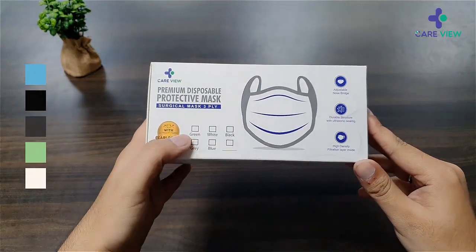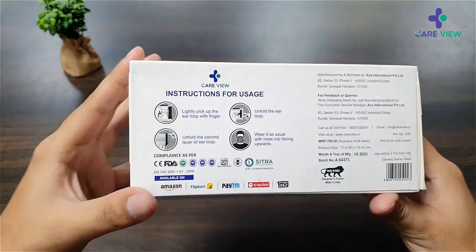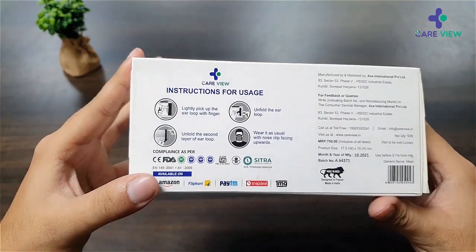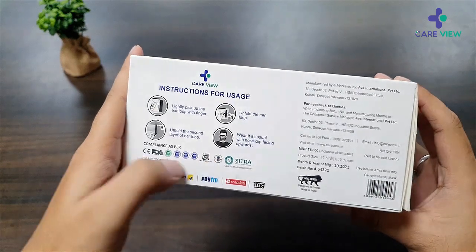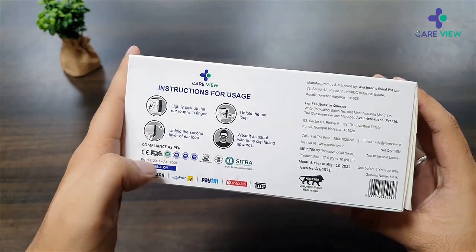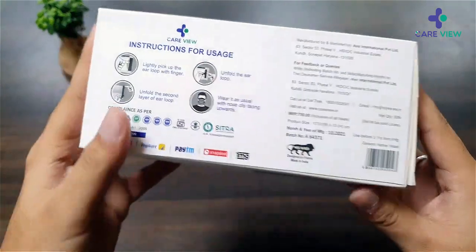Here is the box — the packaging seems very nice. It's available in many colors, and here are the instructions on how to use and wear the mask. It's approved by many government bodies, including FDA and ISI, and it's available on many platforms.